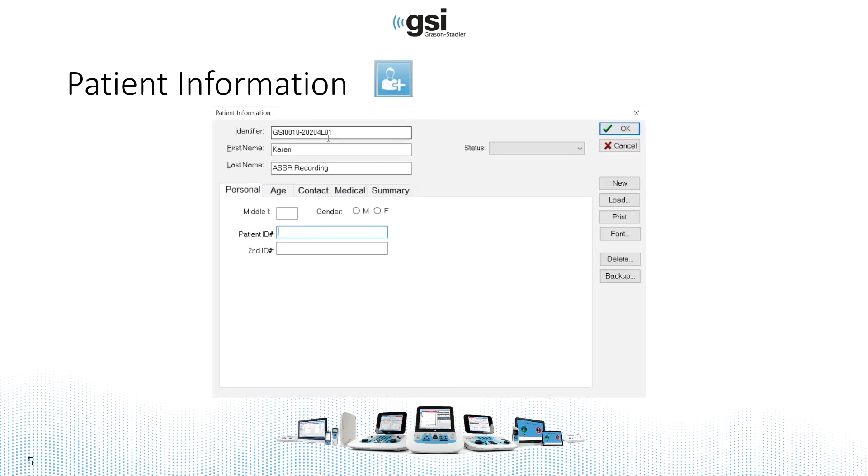Here you can see the information window. The only thing that's required is first name and last name, so you can quickly add those two pieces of information and fill in the rest at a later date.